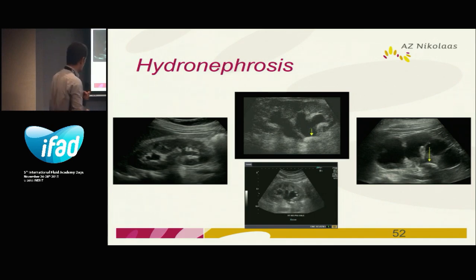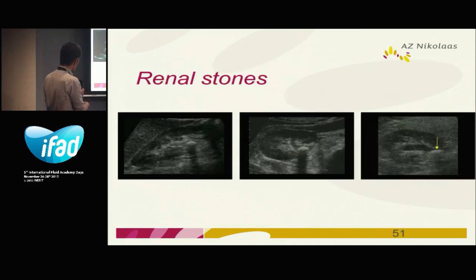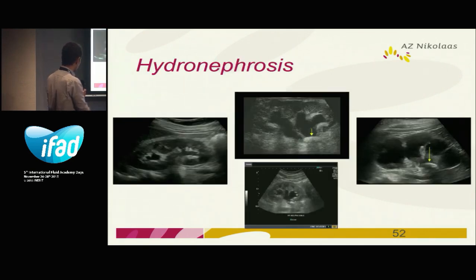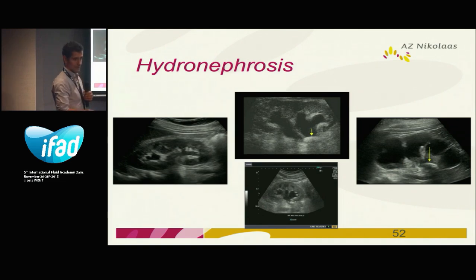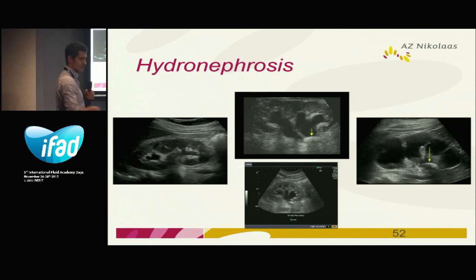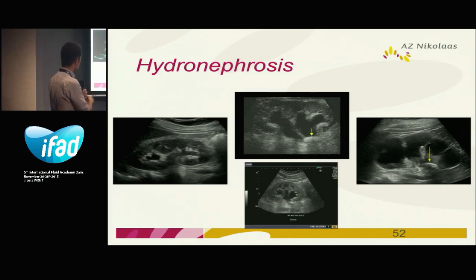Looking at dilatation — very easy. You look at the kidney: here is the parenchyma and the sinus renalis. If there is dilatation, you will see it in the sinus renalis. This is grade 1, grade 2, and this is grade 4 dilatation. Sometimes you need to differentiate veins or arteries from the collecting system — put your color Doppler on it and you will see whether it's veins, arteries, or the pelvicalyceal system that's dilated.